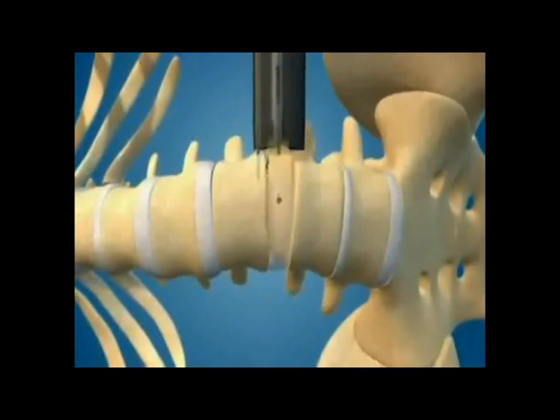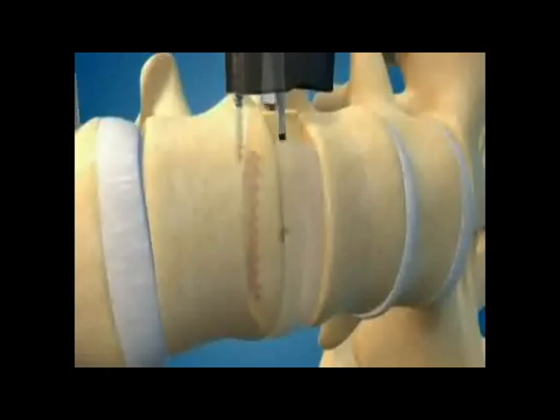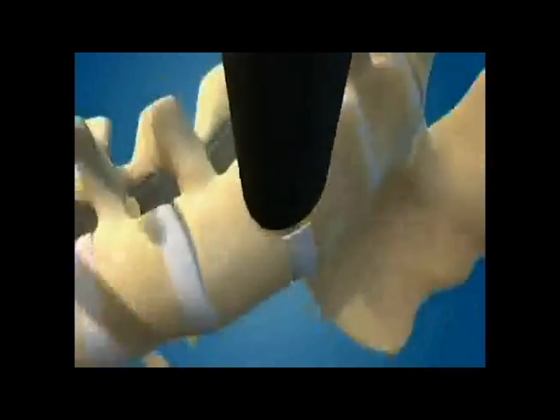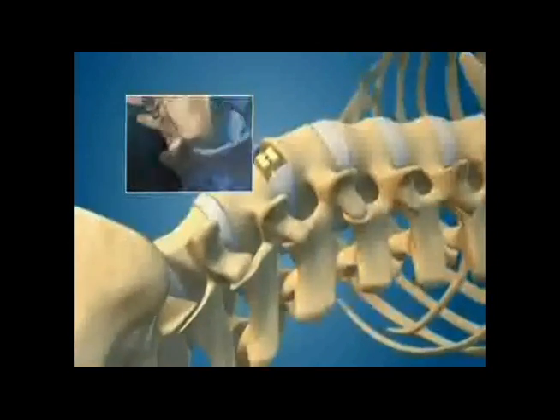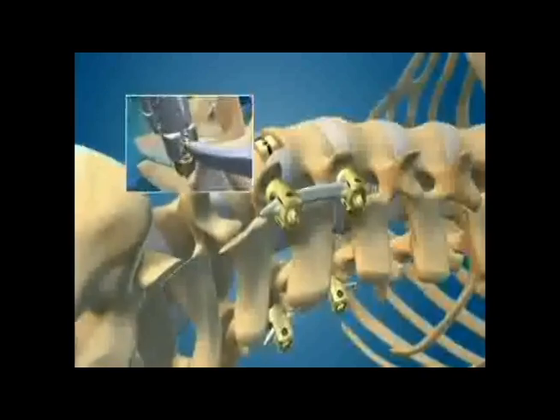The implant with bone graft is then inserted through the opening, allowing for the spine to be distracted at the disc space, again under direct visualization. The port is then removed and the incision is closed.